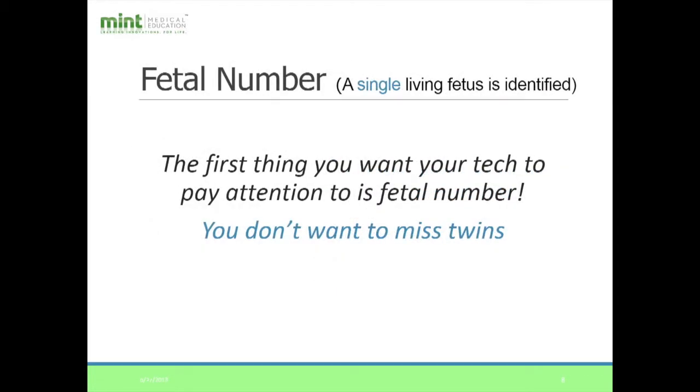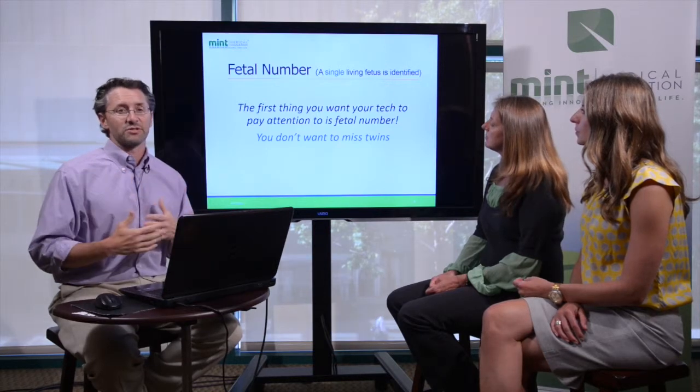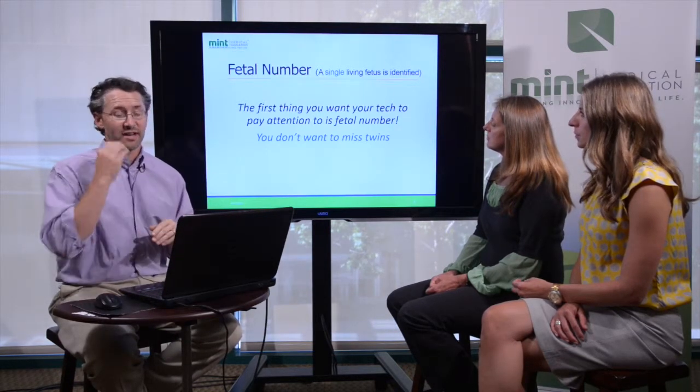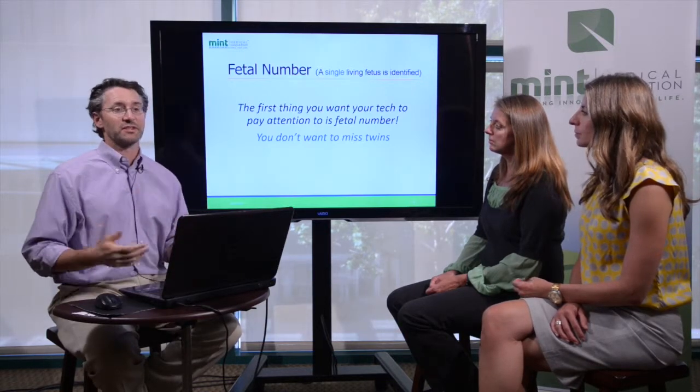Fetal number. The first thing you do when you start looking is count how many fetuses are in there. And the important thing here is you do not ever want to miss twins. It sounds silly, but it happens all the time. People miss twins all the time.